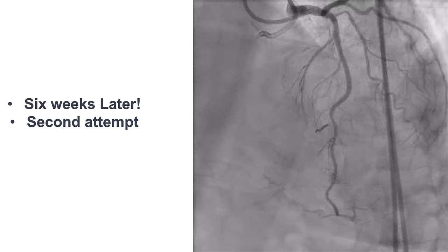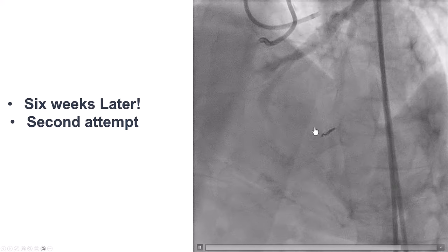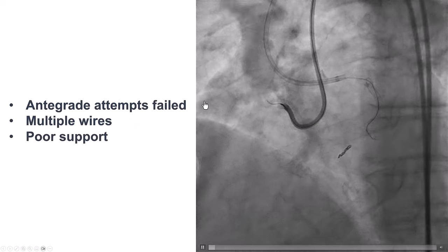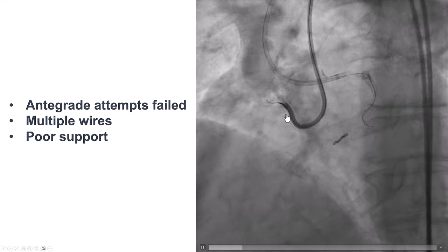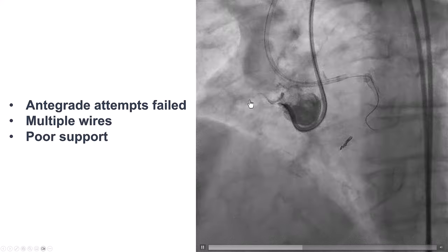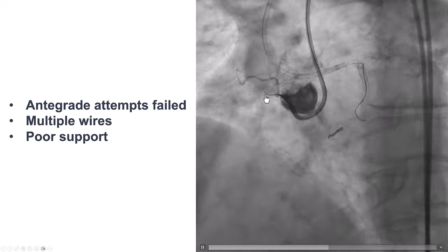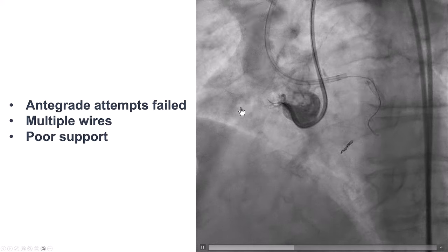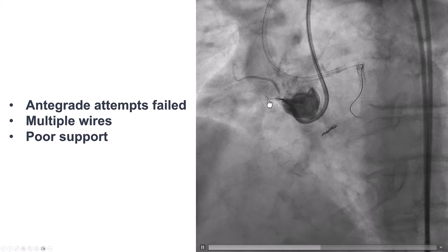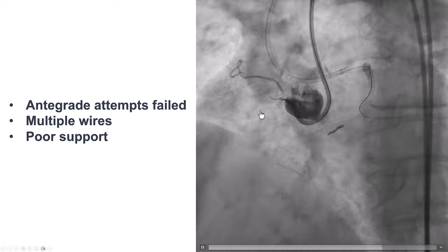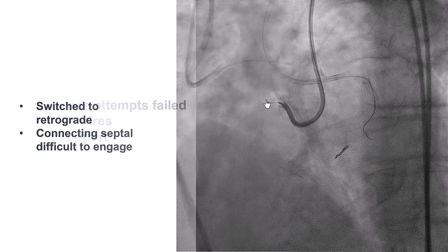Six weeks later, the patient came back for a second attempt. We could see the coil placed in the epicardial branch. We first tried to go antegrade, using multiple guide wires — Gaia X2, Gaia X3, Confianza Pro 12 — but had a lot of difficulty penetrating, which comes as no surprise given the severe calcium seen on CT. Interestingly, the calcium is not quite as visible fluoroscopically, showing the limitations of fluoroscopy and angiography for detecting calcium. We were unable to penetrate through the proximal cap.